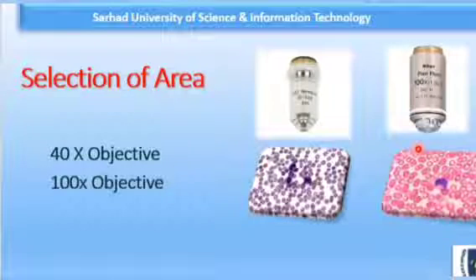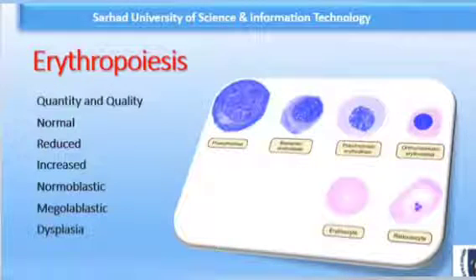Whenever you are looking at the cellularity, then you look for megakaryocytes, then osteoblasts, macrophages, mast cells, and endothelial cells. Looking toward these cells, you may then find some abnormal cells. Now the exact hematopoietic cells you are looking for, like erythropoiesis, myelopoiesis, and some parasites. Now you are doing the myelogram. So let's start from here.